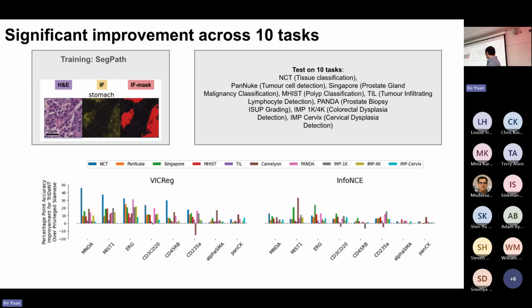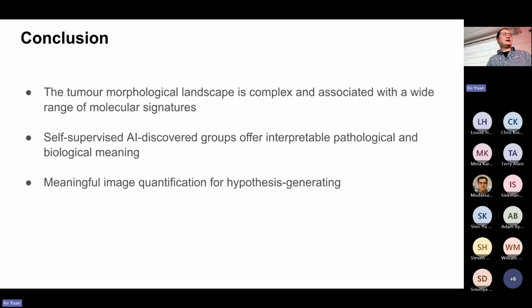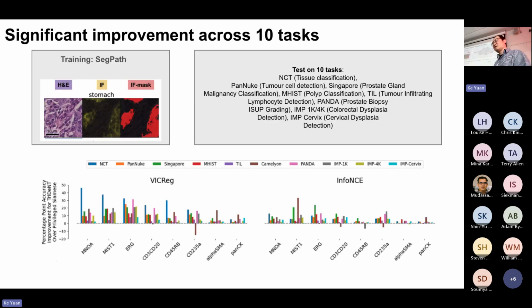Using these two objective functions, we find the Trident architecture really can bring very common benefits across multiple markers. There are some markers with a notable drop in performance. Maybe that particular marker is just not very good for that task. But hopefully that gives you the idea about where we're going with this.